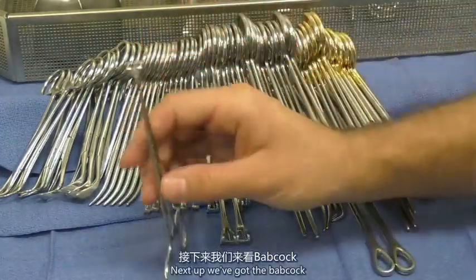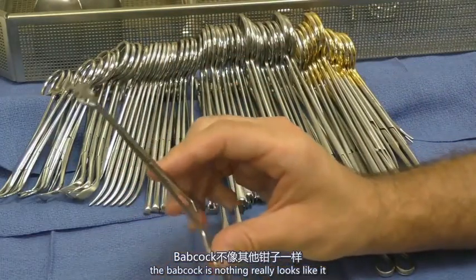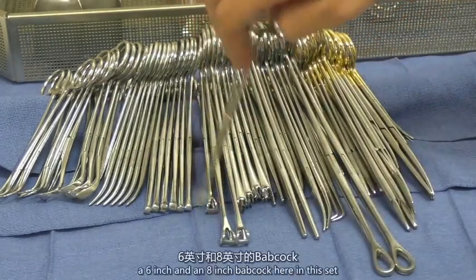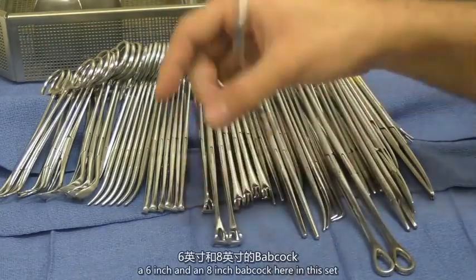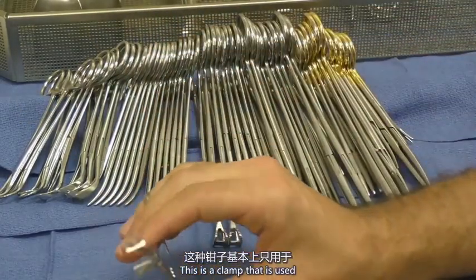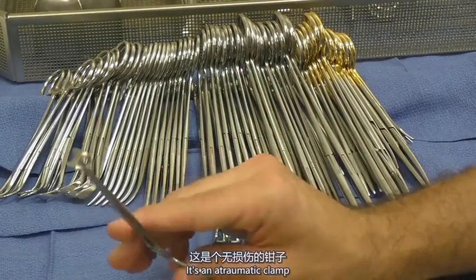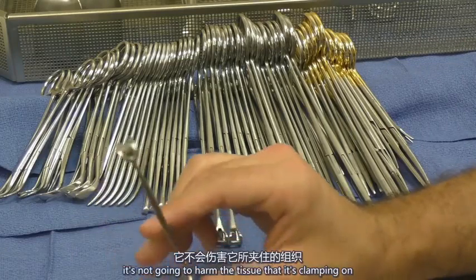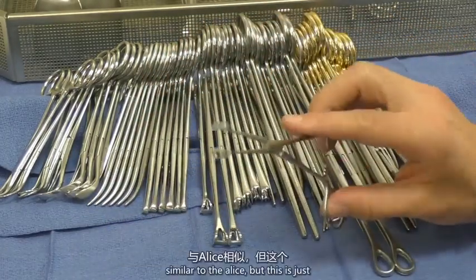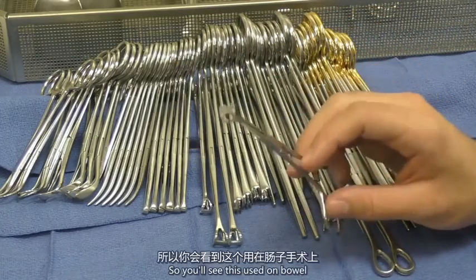Next up, we've got the Babcock. Nothing really looks like it. And it looks like I have a 6-inch and an 8-inch Babcock here in this set. This is a clamp that is used pretty much solely on bowel. It's an atraumatic clamp. It's not going to harm the tissue that it's clamping on, similar to the Allis, but this is just a little bit lighter on the tissue. So you'll see this used on bowel.